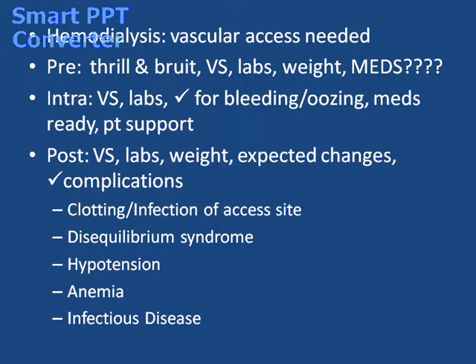You need to have specialized training in this. But we're going to monitor for bleeding, any oozing at the insertion site. They're going to look at the coag studies. They may be giving anticoagulants if there's any prescribed. Typically it's heparin. And then also they're going to want to have protamine sulfate on reserve in case we need it, because that does reverse heparin.